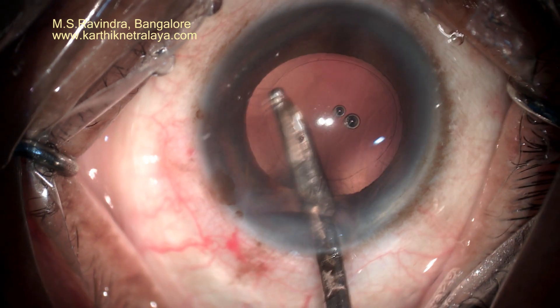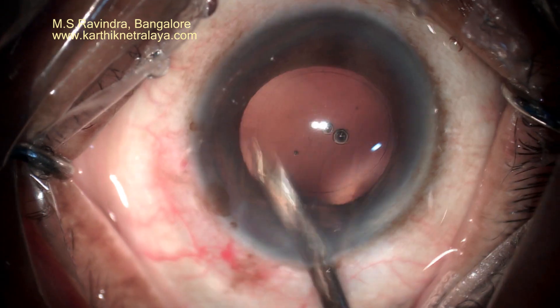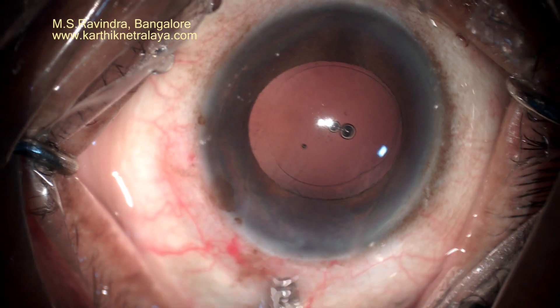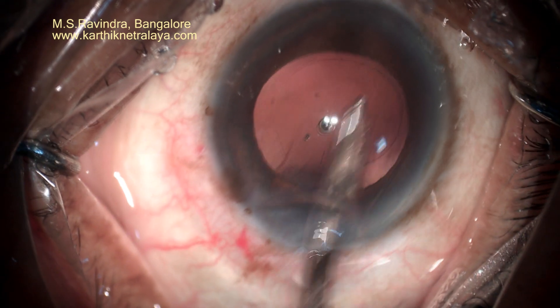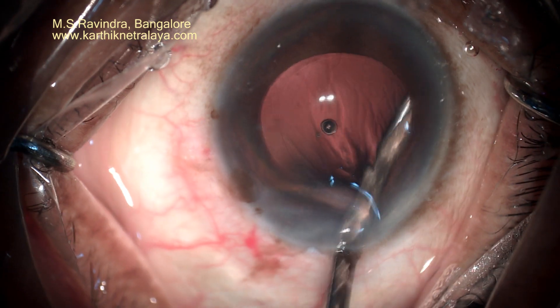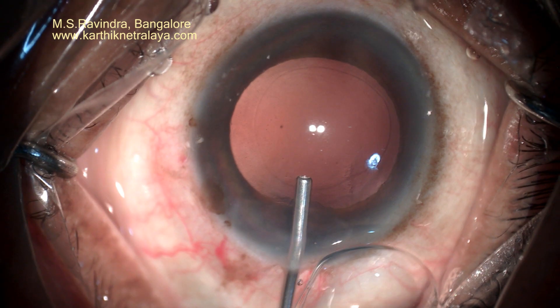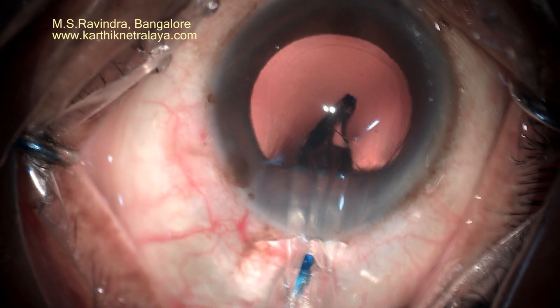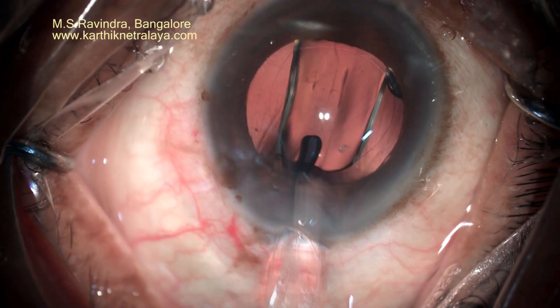The cells on the back of the anterior capsule can be polished. The endothelial damage is least in this technique. There is a single port and it does not need a side port. The instruments that are needed are few and can be easily cleaned and thoroughly autoclaved, with no need to use any instrument without proper sterilization.